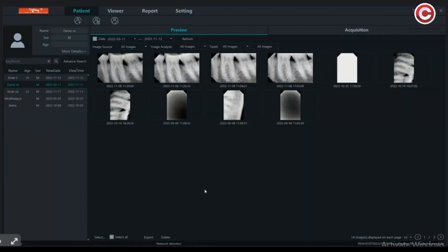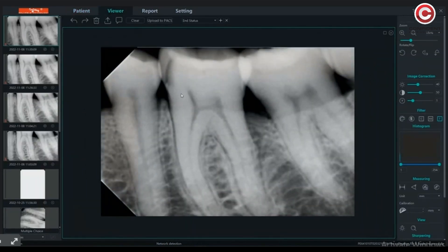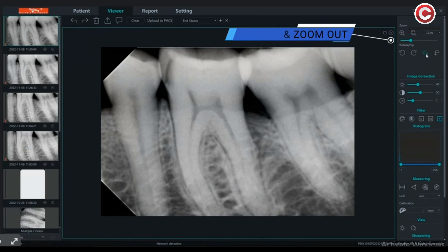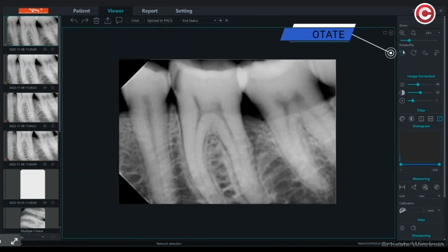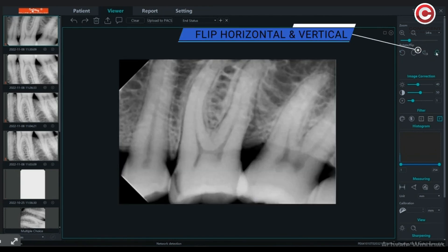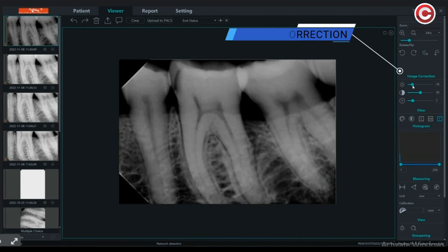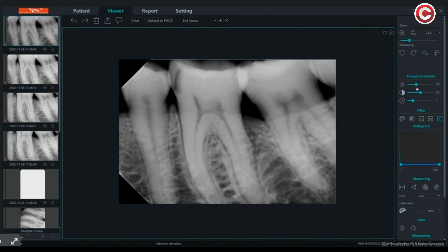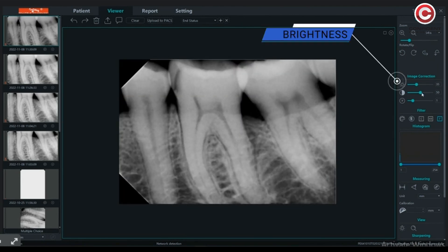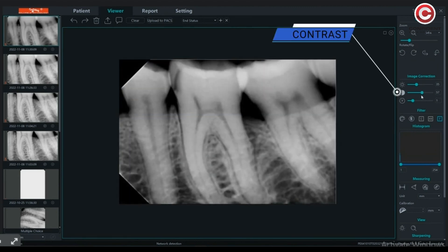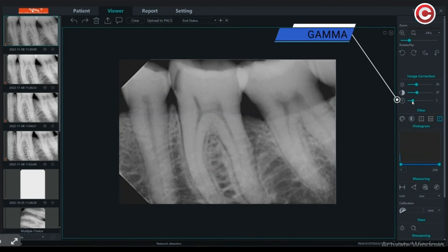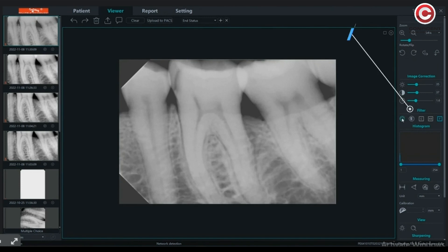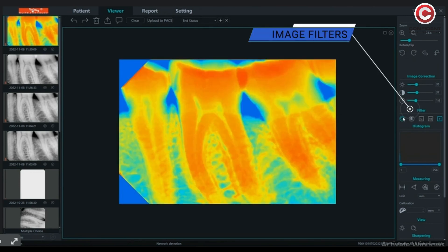Select the image you want to inspect. Once the image viewer is opened, you have options to edit it. You can zoom in and zoom out. The image can be rotated in either direction. Horizontal and vertical flip options are also available. There is an image correction tool using which you can control the image brightness, contrast, and gamma. You also have various image filter options which you can adjust.